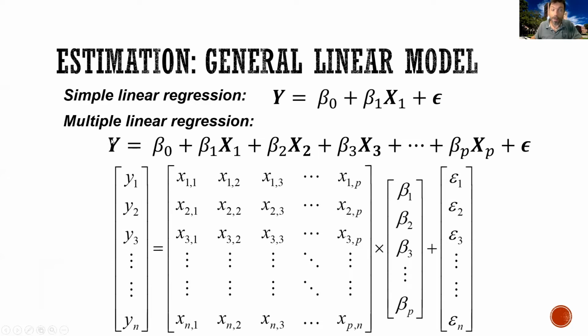So y, the vector y, is the series of values that are taken by a single voxel over time. So this is the value in voxel 1 at time point 1, voxel 1 time point 2, time point 3, time point n. And we're trying to predict this with a number of regressors, or independent variables, which typically some of them code the onset and offset of our conditions of interest. And this matrix could also have in it some regressors of non-interest, or some covariates. Then, of course, we have our vector of parameters, which is what we're trying to estimate.